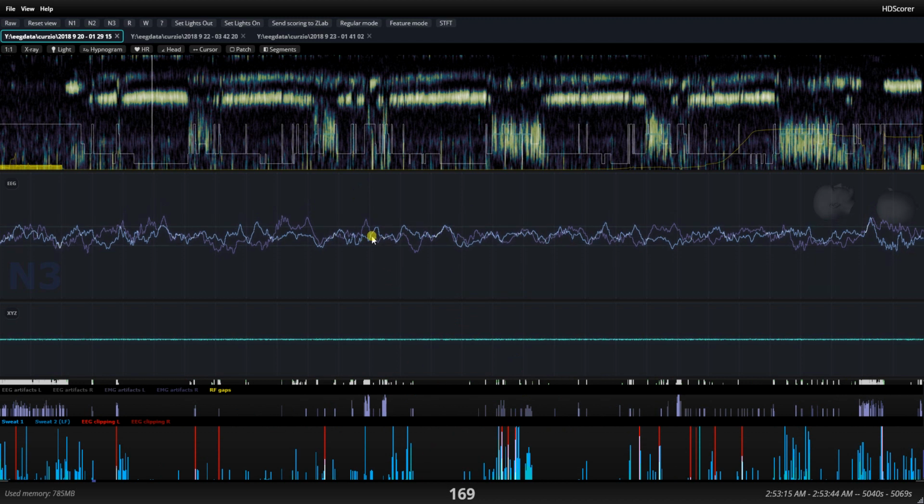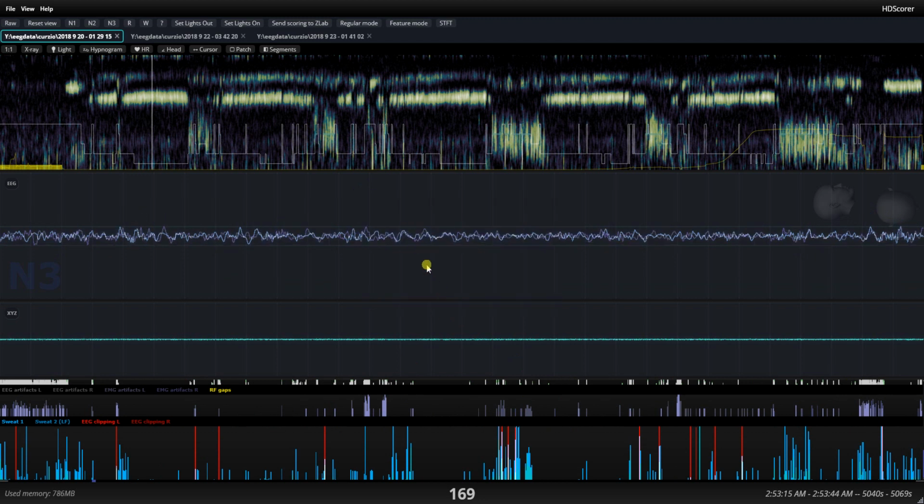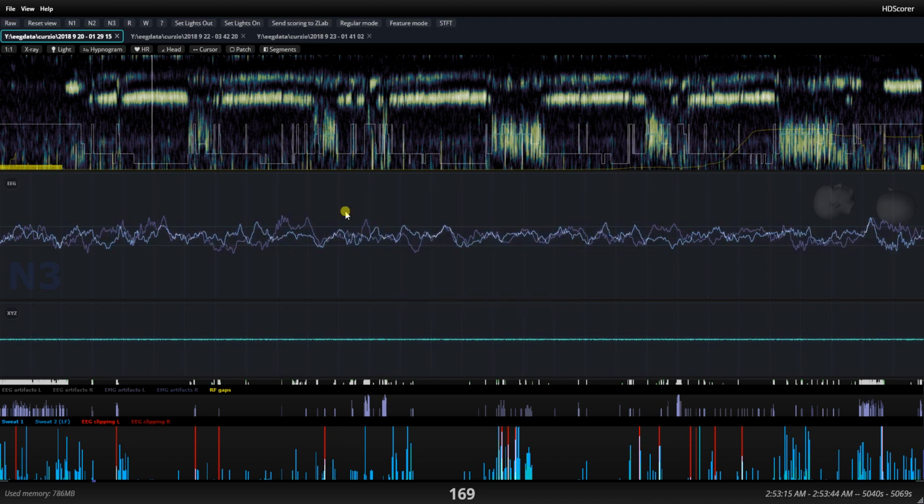people that sweat. And when you do sweat, what I notice that the sleep technicians do is to simply filter, filter, filter. Every time I complain, oh, look, there's sweat, they just suggest filter. But filtering doesn't work because the frequency range of sweat and delta waves is overlapping. So you can't just do that very easily. The other problem that I have with AASM rules is that there's no clear guideline as to what kind of electrode you should use to measure. If you measure at F4 versus F3 versus somewhere else, it would give you a different result. These delta wave amplitude changes.